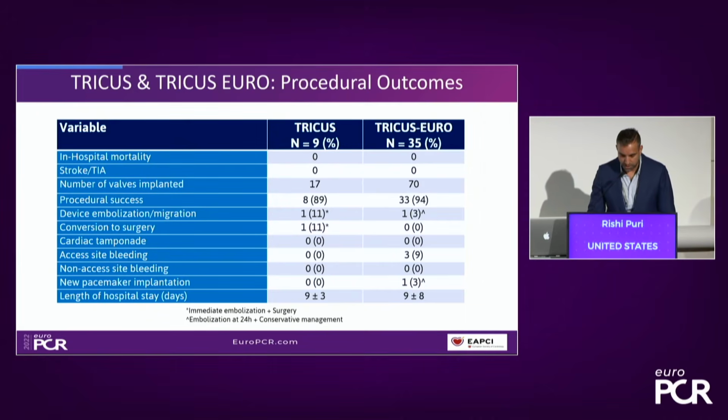for those of us who are involved in treating these patients with other transcatheter tricuspid valve technologies. Procedurally, you've seen Dr. Hausleiter show you a beautiful example of a smooth procedure done under local anesthesia, transthoracic echo, skin to skin, in probably 25 to 30 minutes. And so surprisingly here, you don't really see any major catastrophes during the procedure. You're not doing fancy maneuvers or acrobatics like some other devices require you to do, and you can have a very streamlined, short learning curve and a nice procedure with no major dramas.